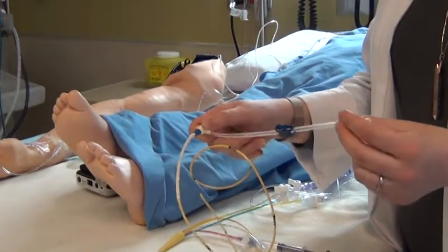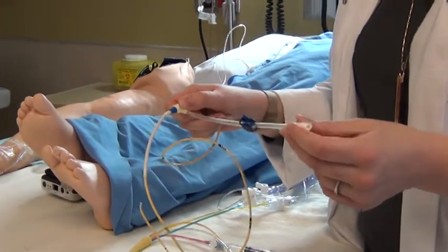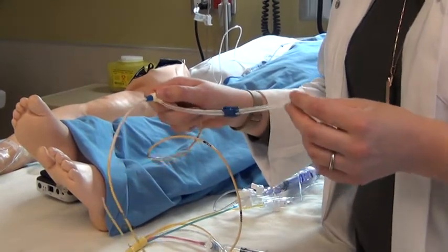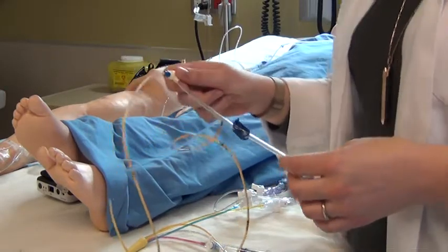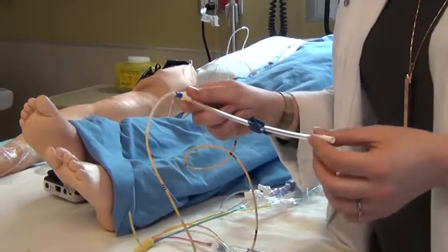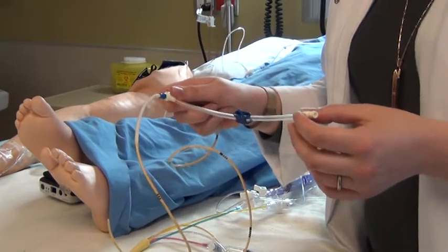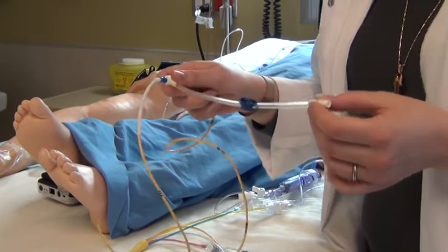This piece here is connected to IV tubing, so if we're infusing normal saline or Ringer's lactate it will be connected to regular IV tubing and used as IV therapy for the patient. Often medications such as vasopressors, vasoconstricting agents, or inotropic agents will be delivered through this line.